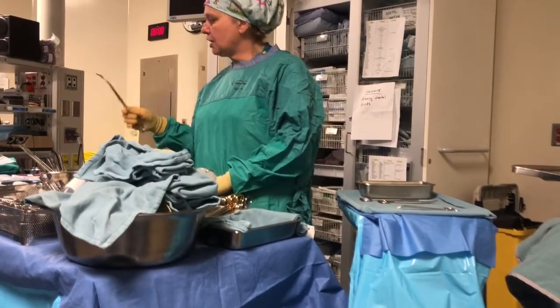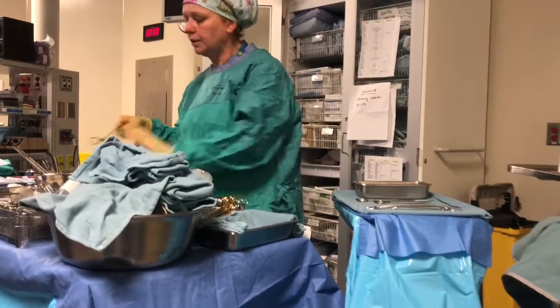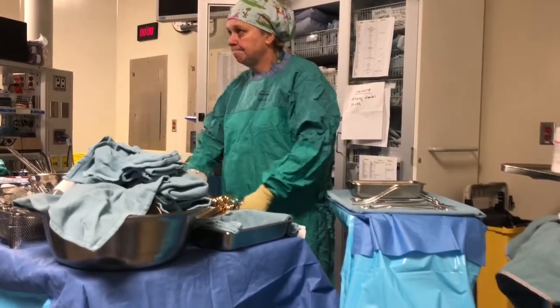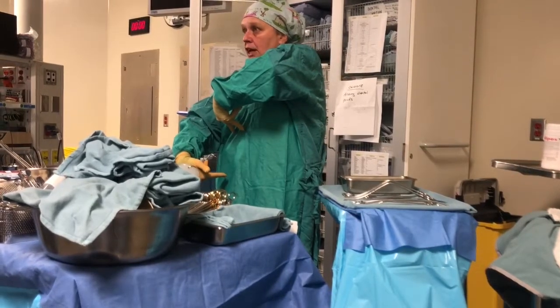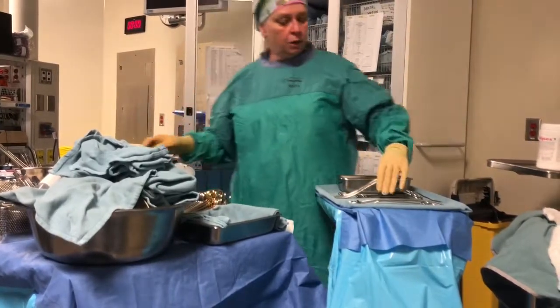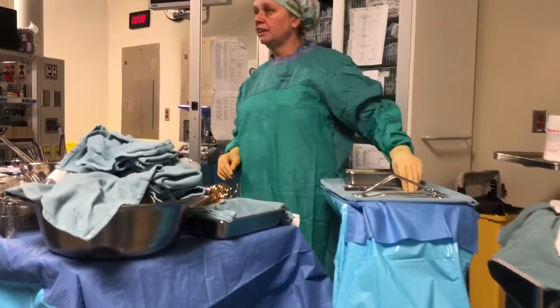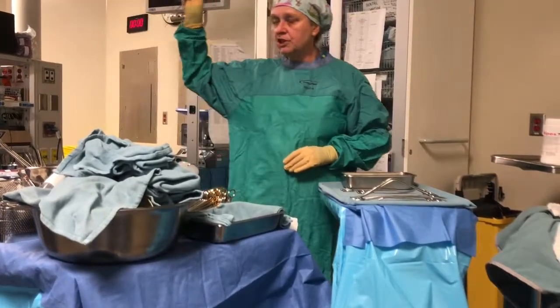If it's a smaller patient, I would probably have a coarctation clamp up, I would probably have 2 iliacs, because like I was saying to you with an aorta, they're going to clamp off at the top of the aorta, and they're going to clamp off 2 iliacs at the bottom, right? That's what they're going to do. Either that, or if the bleeding's really bad, they're going to clamp on either side of the aorta, okay? But they still would probably either use an iliac or another coarctation clamp, right? And then I would start out with maybe just a pair of short tissues, just to get started. But immediately, once they're in, I would switch right away to a nice long DeBakey, which is delicate, right?